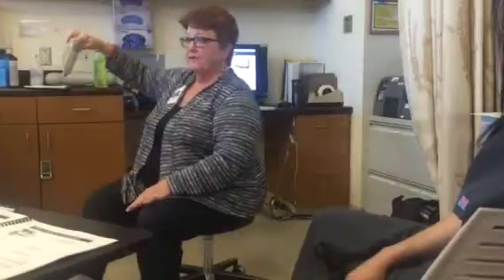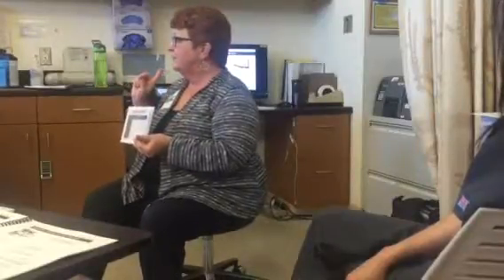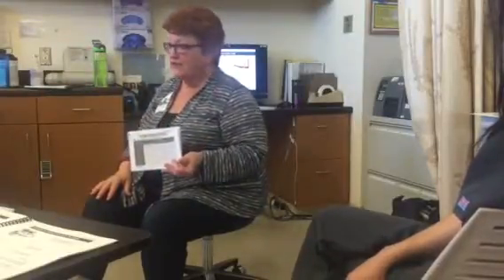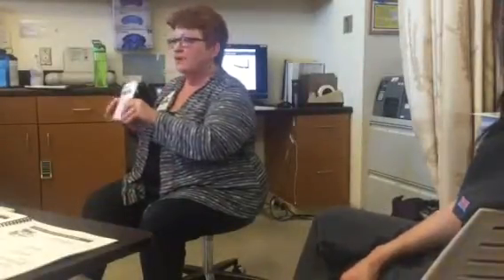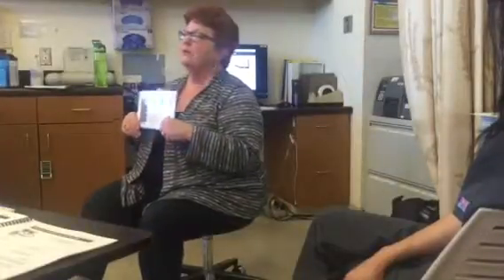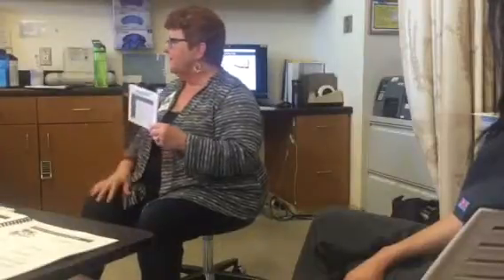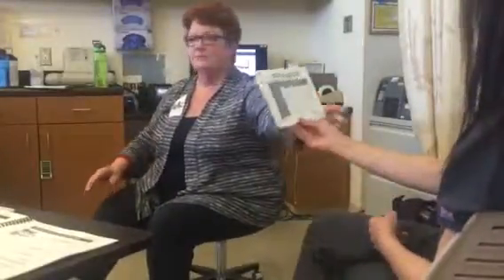What you should do is consult this right from the get-go. Because you know your inlet pump, you know your white count, right? Or eventually you will. And the machine will always default to 1 milliliter on the collect pump, just like Spectra did. But that may not be adequate if you all run fast and you have patients who have decent counts. That is why the engineers developed this. Now, it used to be a calculation tool on the internet. But in some instances, people didn't know about it or couldn't get to it because of where they were in a hospital and it was blocked because of firewalls. And so the engineers have now so kindly just made a laminated card. Want to see it up close and personal?